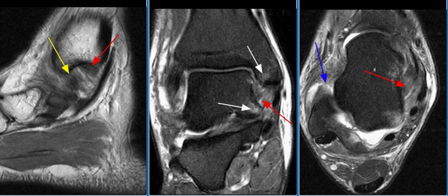The medial or deltoid ligament complex attaches to the apex of the medial malleolus and consists of superficial and deep portions. The superficial part is formed by the tibionavicular, tibiocalcaneal, tibio-spring, and superficial posterior tibiotalar ligaments. The deep part is intraarticular and is formed by the anterior tibiotalar and posterior tibiotalar ligaments.